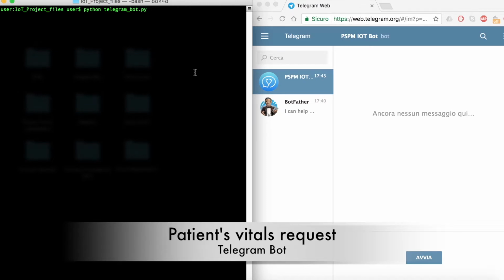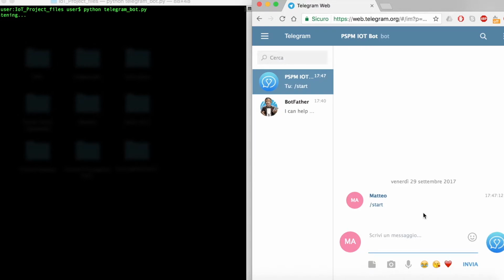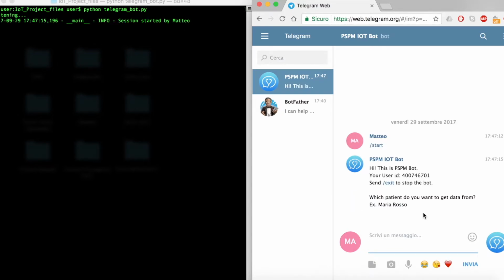Then, we run the Telegram bot, as you can see in the left screen. We will ask for patients' vitals, showing how only allowed users can access them, according to the chat ID provided in the Patient Resource Catalog.